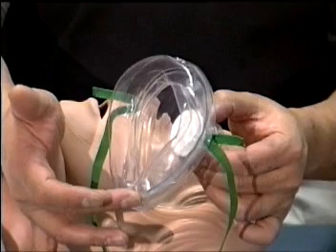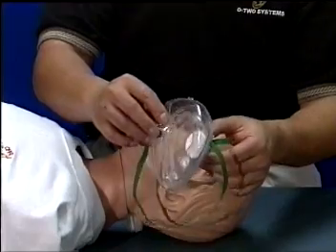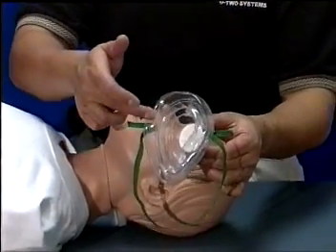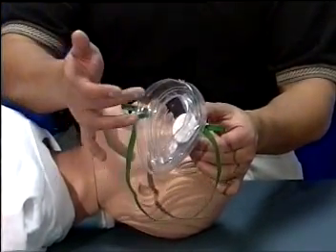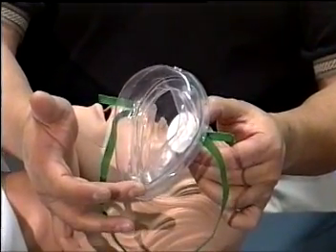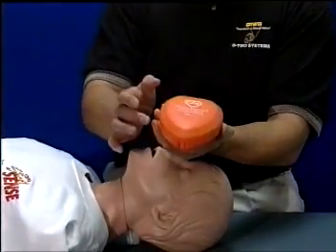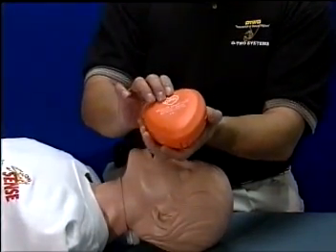If used on infants, the mask can be rotated 180 degrees so that the wide portion of the mask will fit the natural contours of the infant's forehead. The sides of the mask will seal around the natural contours of the cheeks with the narrow end of the mask resting on the point of the infant's chin.